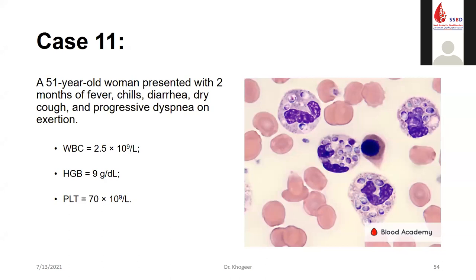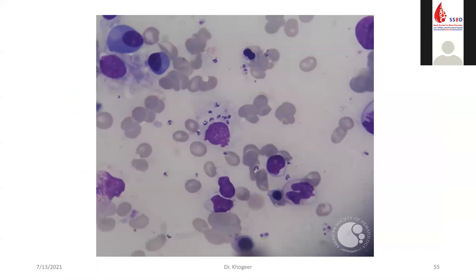Histoplasma is more often intracellular. This infection is reported to be present in 5 to 20% of AIDS patients, and in 95% of the cases it is manifested in its disseminated form. Serum antibody and or antigen testing can make the diagnosis, but demonstration of the agent by culture or histopathological examination remains the gold standard method. So remember, Histoplasma is usually seen as intracellular inclusions, and this is a fungal infection. But this is another picture, any guess?